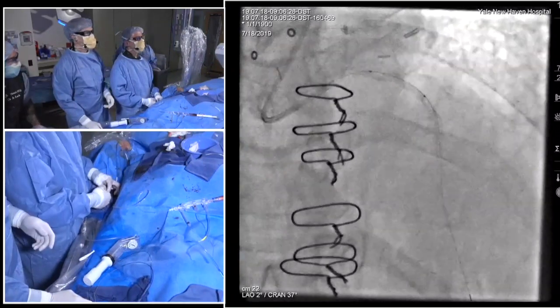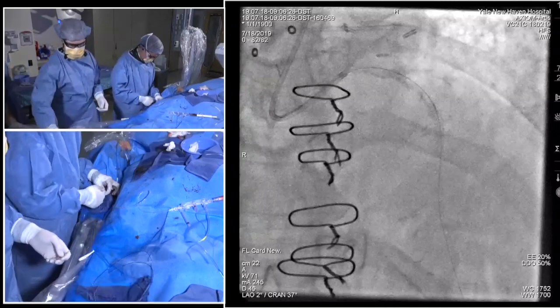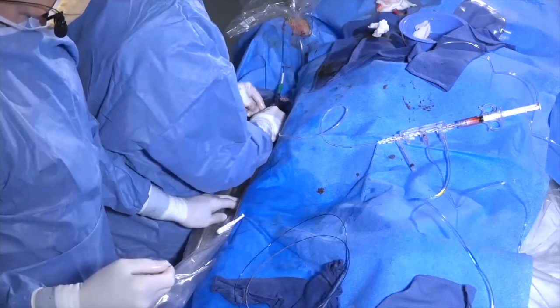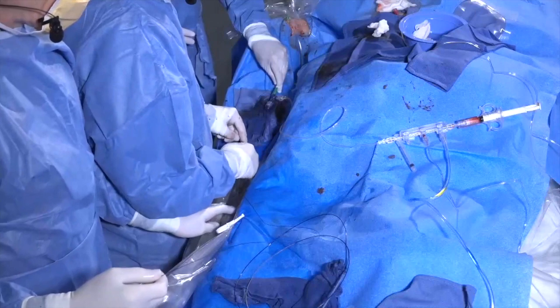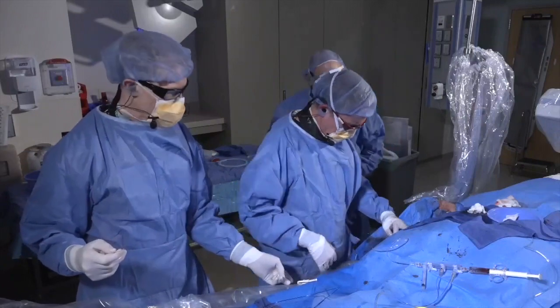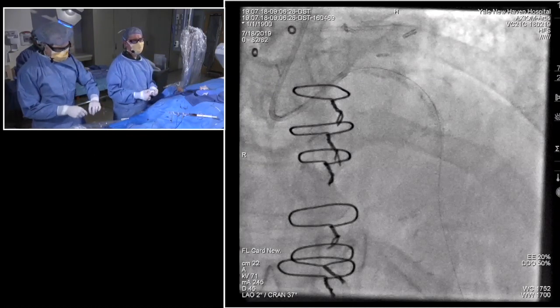I think you need to see more prospective data, particularly in high bleeding risk patients. But data like SENIOR does give you a little bit more comfort in people who have to stop. Yeah, because some people come in with a complication, have to stop, and then you feel okay about it. So that expanded pretty well, and I think you sized it perfectly, landing it distal to the diag, so you're not going to double jail it. Deliverability seemed very reasonable. Worked out great, yeah.